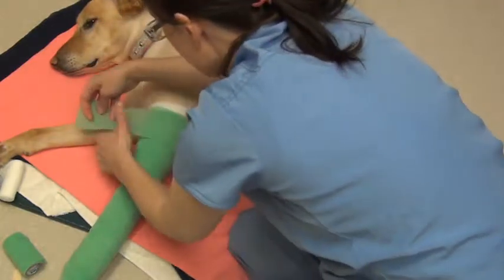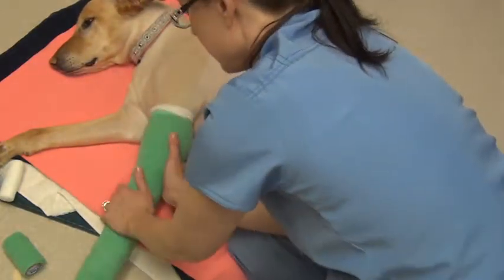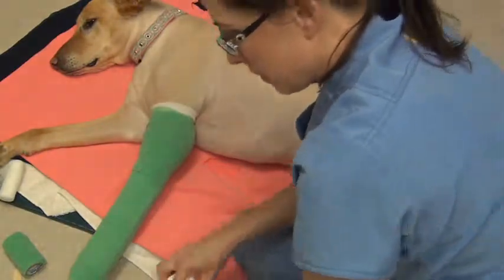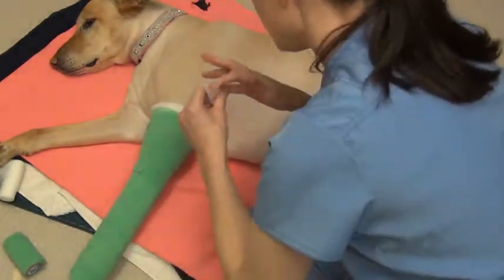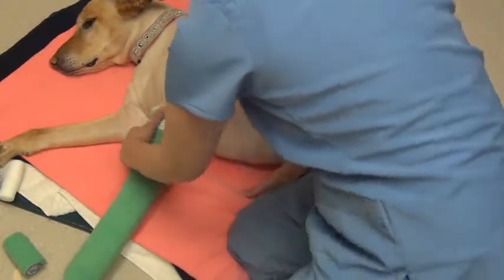I'm going to go ahead and get some tape and finish this by dating the splint, the bandage and the splint. Toes are out. I'm placing a piece up here to seal the last wrap that we put up here. And I'm going to write the date on here.